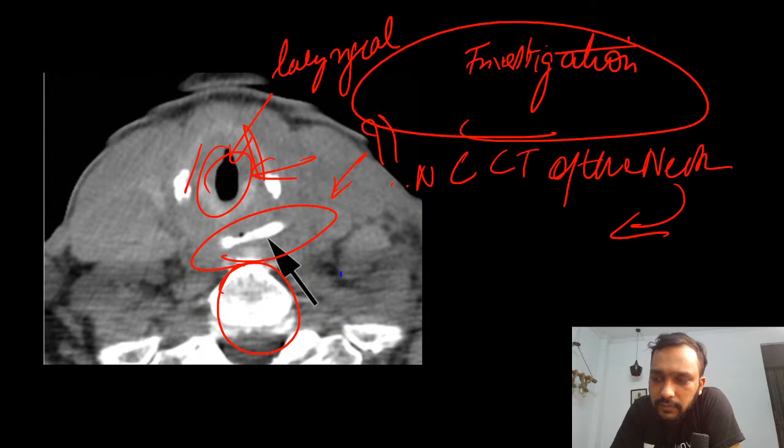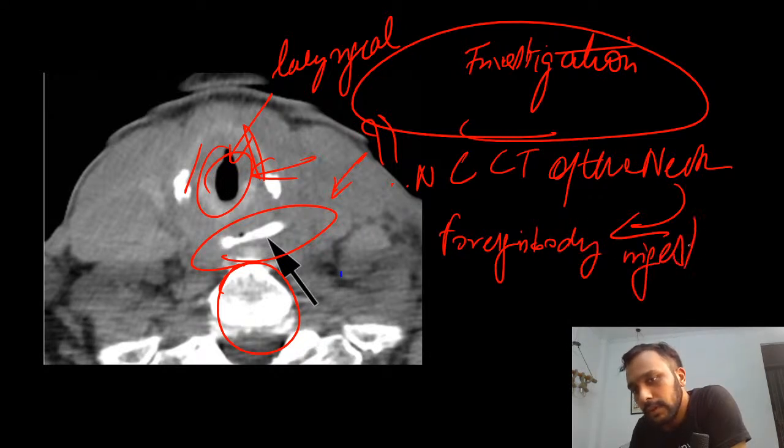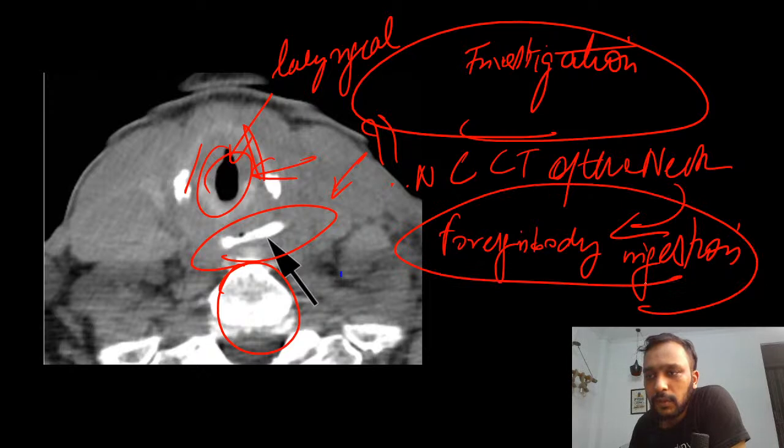Esophagus, very good. What are you seeing within the esophagus? Very good, Tanmay Gupta. So guys, this was a case of foreign body ingestion. Very good, guys.